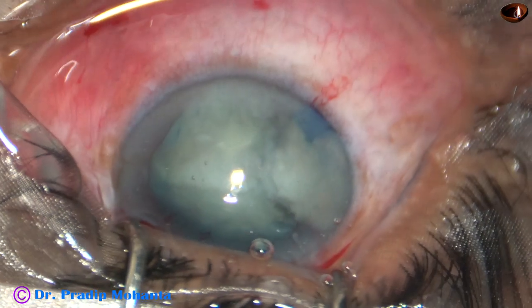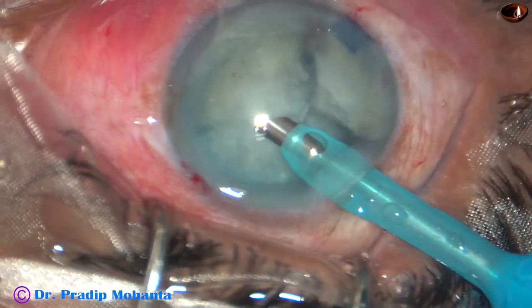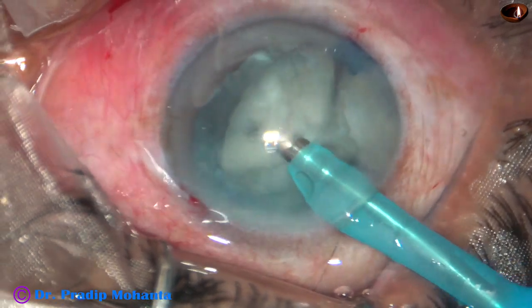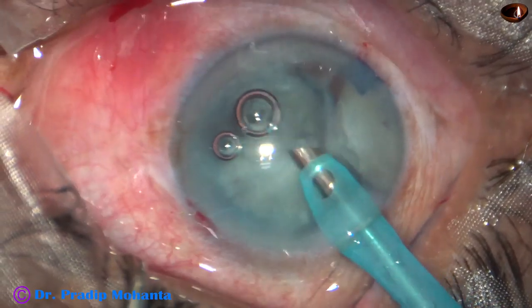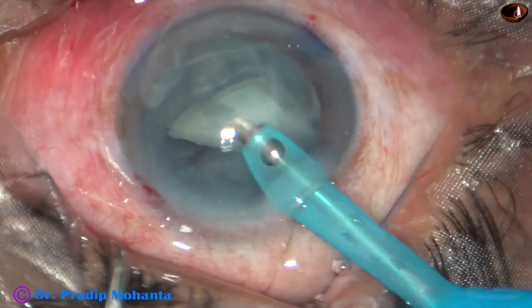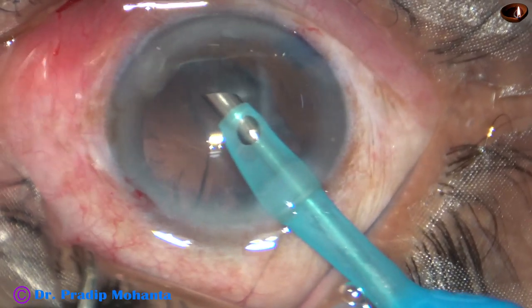Now I inject 2% HPMC viscoelastic and then go into the anterior chamber with the phaco needle. I'm not using a chopper because the nucleus has already been divided. Bottle height has been decreased to 60 centimetres — I usually use 100 centimetres of bottle height. Since I am using irrigation and aspiration together, the fluid pressure is less on the posterior capsule. Pre-chop is a very good way to manage such traumatic cataracts. And very nicely, the cortex has also come out.